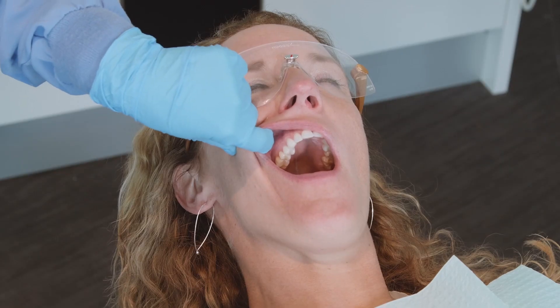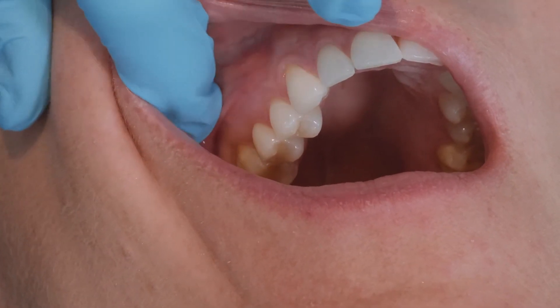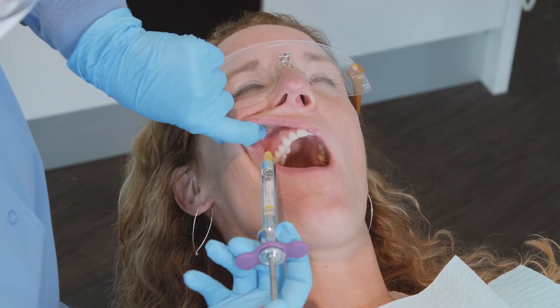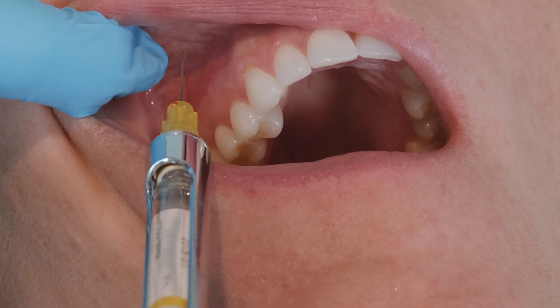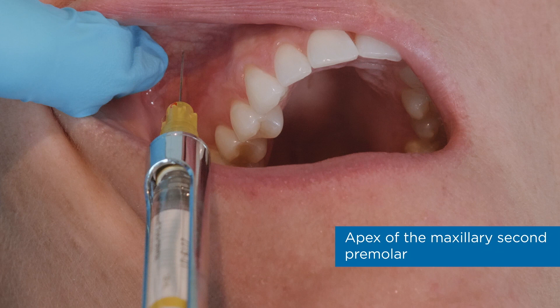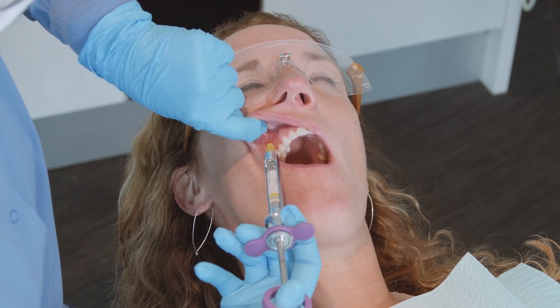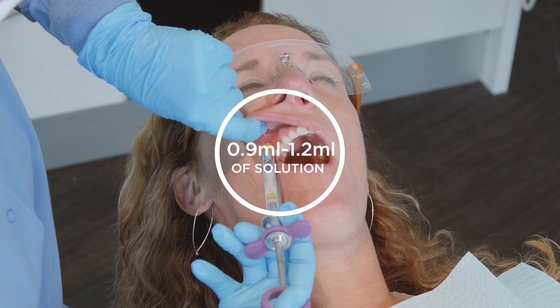For maxillary anesthesia, the alveolar mucosal tissue is palpated at the injection site in the vestibule at the height of the mucobuccal fold, superior to the apex of the maxillary second premolar, to ensure only soft tissue is injected. Using a 27-gauge short needle, orient the syringe parallel to the long axis of the tooth with the large window facing the operator. Insert the needle at the height of the mucobuccal fold at the apex of the maxillary second premolar, approximately one-fourth of the depth of the short needle — about five millimeters — or until the bevel is slightly superior to the apex of the tooth. Aspirate within two planes.